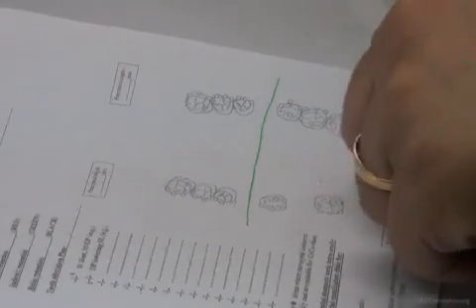Okay, I do it all on one side. Here I have a lingual plate and I have a connector here. Lingual bar in the anterior areas, plate, but it goes like a bar on the posterior areas, and that's it. Can I do that? What plate? Okay. The lingual plate is also the shape of the lingual bar when it extends to the saddle area. We also call it a plate. Okay? This is a good question.